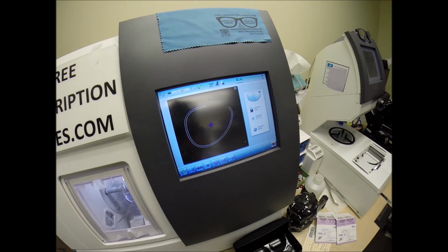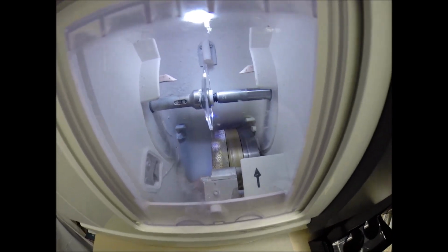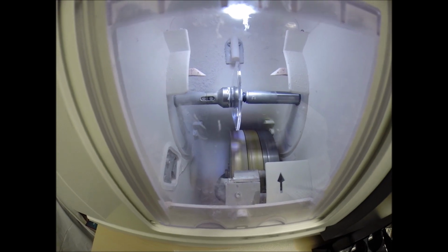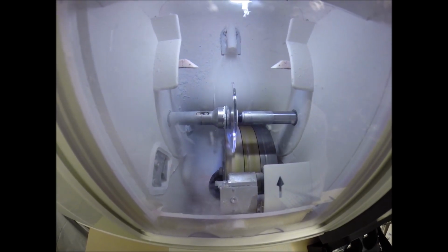You can see as it's tracing the shape that it'll be cutting. And then the old carpenter saying measure twice, cut once. It's measuring the thickness of the lens at every point to know exactly precisely where to place the bevel so you have the least amount of edge thickness showing, of which you'll have none. But I do cut strong prescriptions all day long for free, and that does become a little bit more critical.